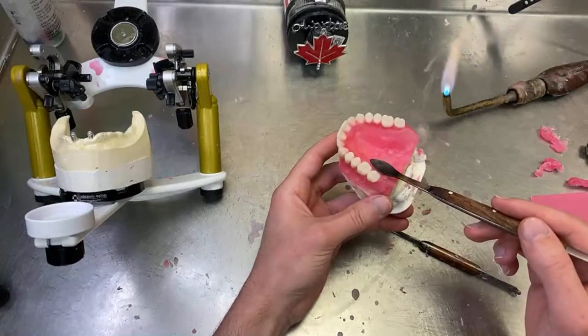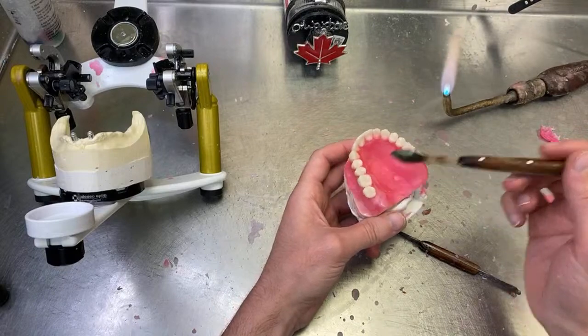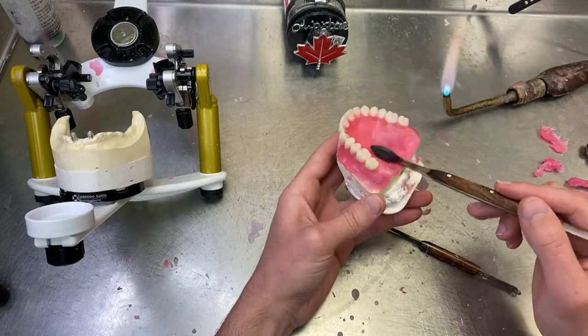Just the posteriors, because the anterior is going to need a lot of trimming with the implants.